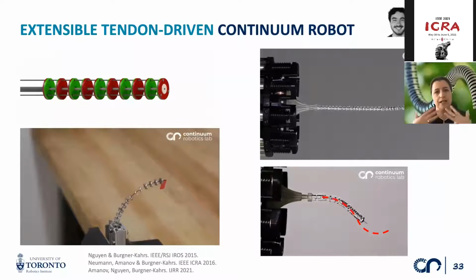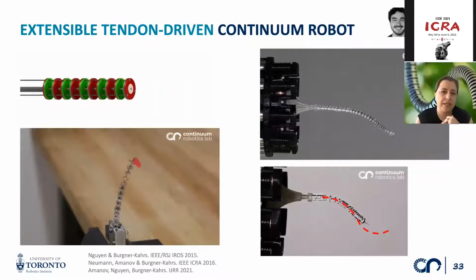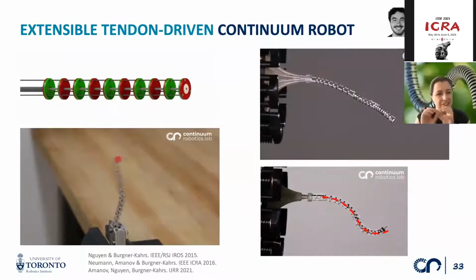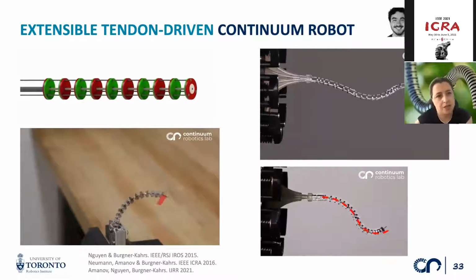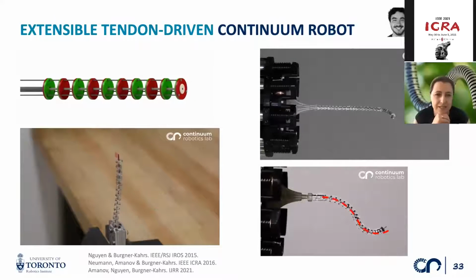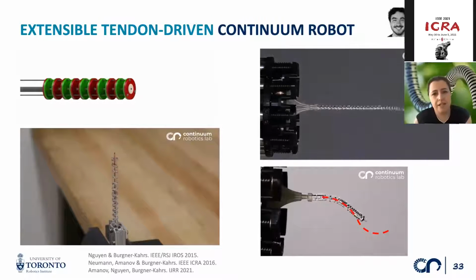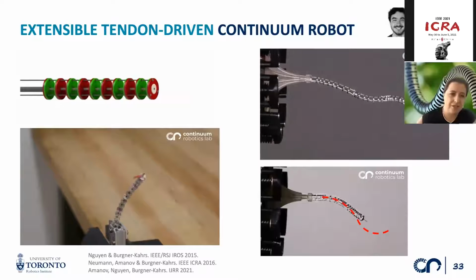And so our take on enabling extension and contraction in continuum robotics is by building a continuum robot that uses the best of two worlds. So we are using tendon actuation for the active steering of individual segments, but we are also utilizing the concentric tube paradigm in order to achieve variable length in those sections. And so an individual section is then composed of one tube that extends and contracts, where the end disc is affixed to. And we use tendons for inducing the bending motion. And then the tendon routing discs are composed of magnets at alternating polarity orientation, such that they always distribute equally and guarantee a good bending behavior.